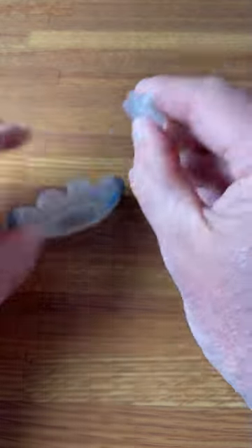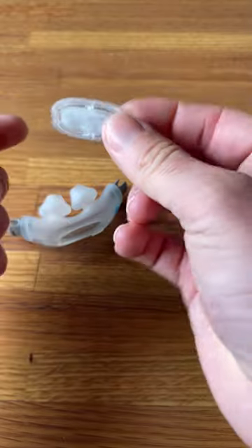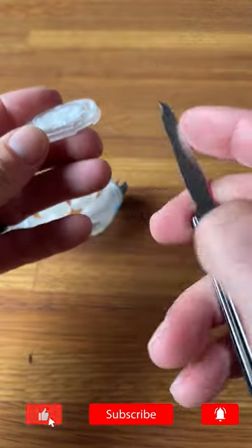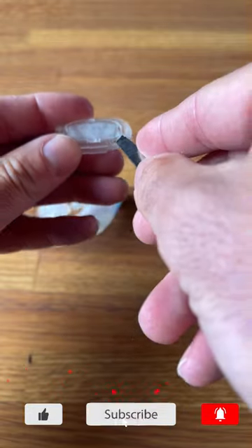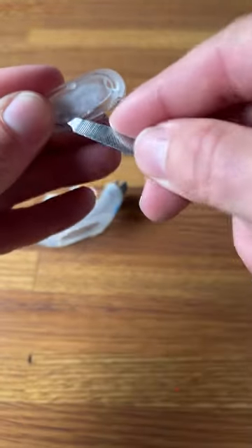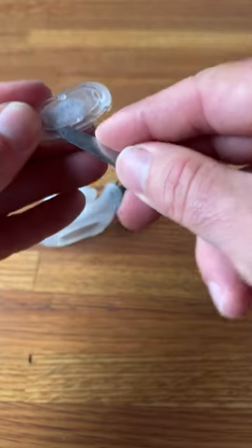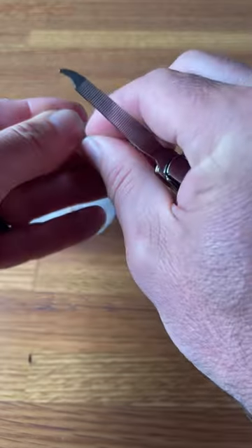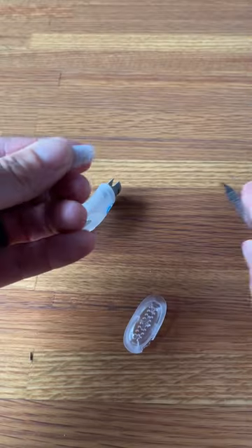You can take this section out, and here in Australia you can buy this little section, but you can't buy it in the US. So I'm just using a little nail file here — just get in that little gap there and work it around, and then you should be able to just pull it out.